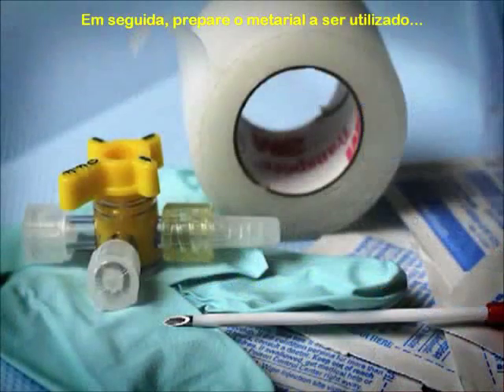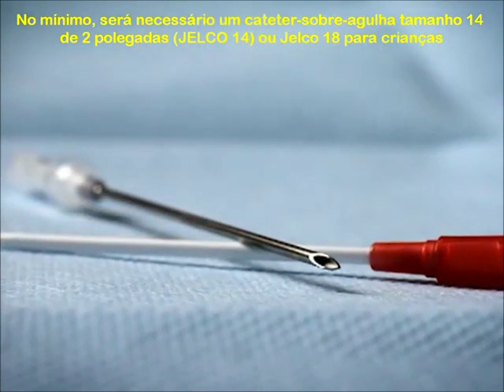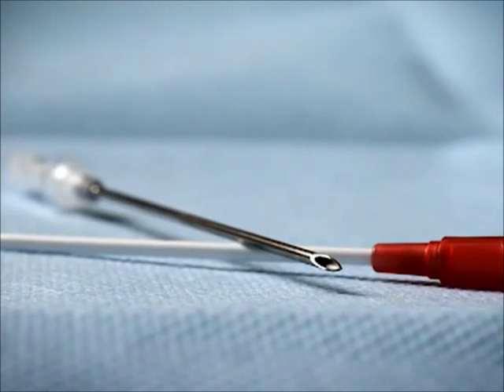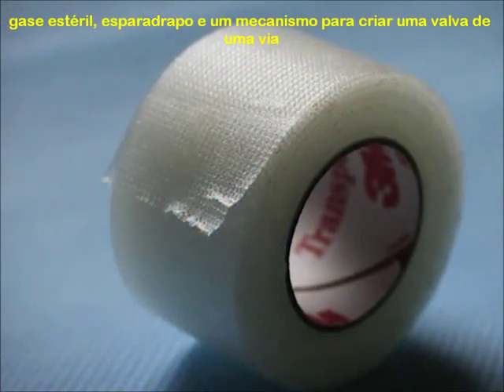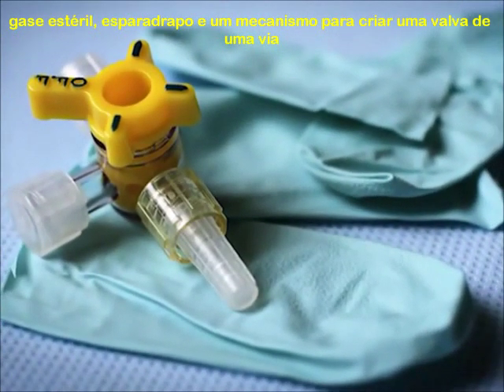Next, prepare your equipment. At minimum, you will need a 2-inch, 14-gauge over-the-needle catheter — 18-gauge for pediatric patients — antiseptic wipes to clean the site, tape to secure the catheter, and a mechanism for creating a one-way valve.